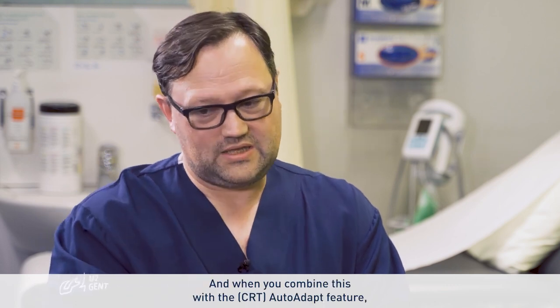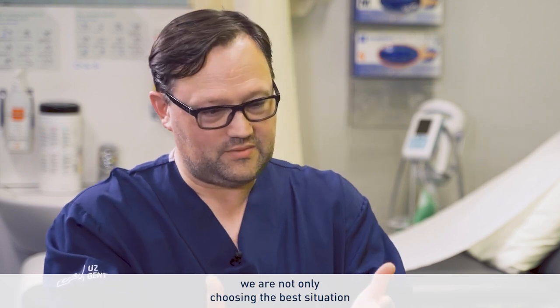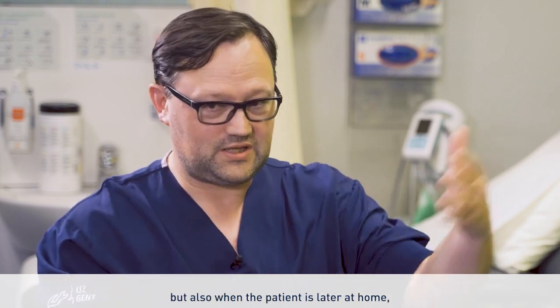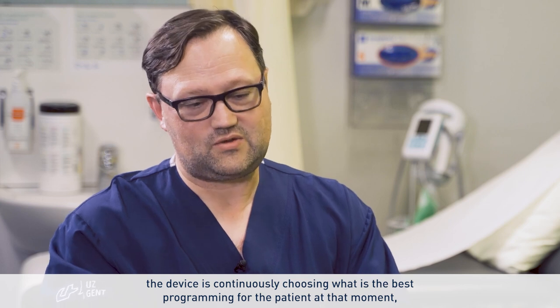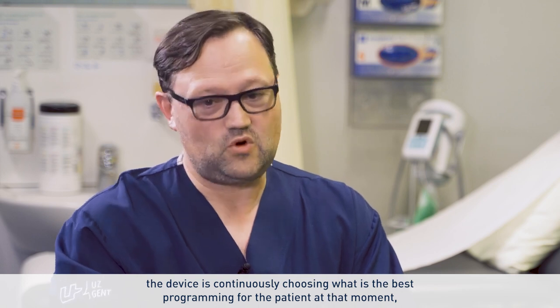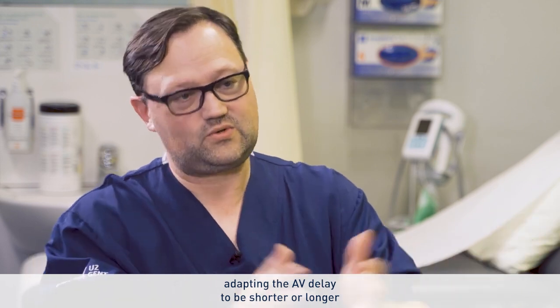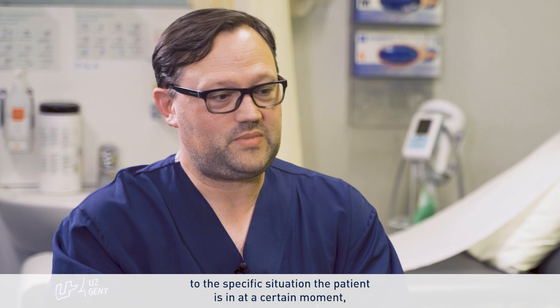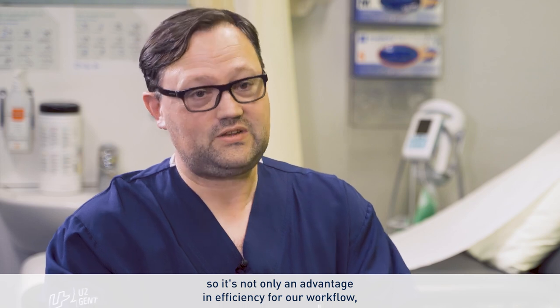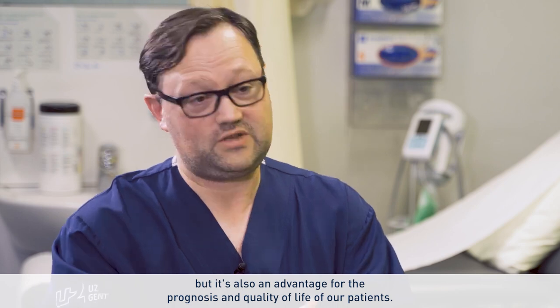And when you combine this with the auto adapt feature, of course, we are not only choosing the best situation at the time of the control in the outpatient clinic, but also when the patient is later at home. The device is continuously choosing what is the best programming for the patient at that moment, choosing between LV only pacing, biventricular pacing, adapting the AV delay shorter or longer to the specific situation where the patient is in at a certain moment. So it's not only an advantage in efficiency for our workflow, but it's also an advantage for the prognosis and the quality of life of our patients.